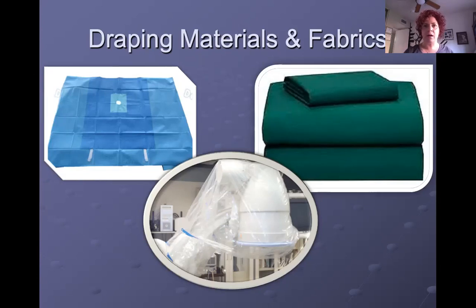However, fabrics that are woven are a little more persnickety because they have to be first laundered, all right? Then they have to come back to the facility. The facility has to fold them, package them, and sterilize them. Along with that, when they are laundered, the launderer has to carefully inspect the fabric to make sure that there aren't any rips or holes or tears.